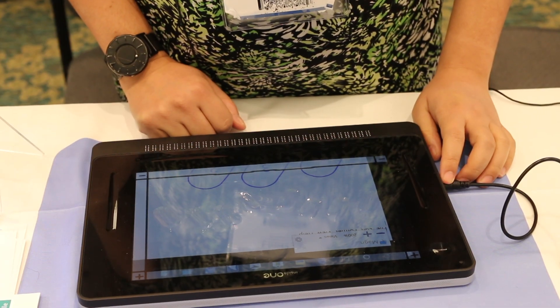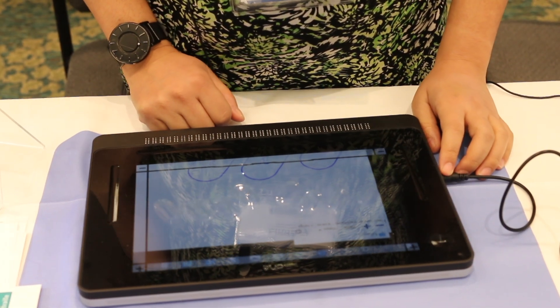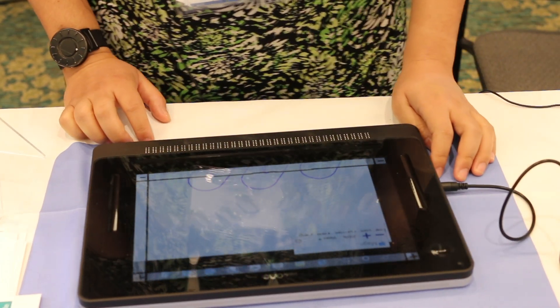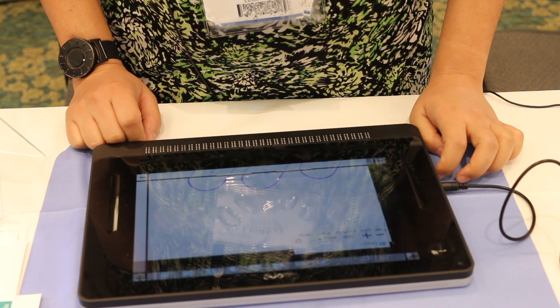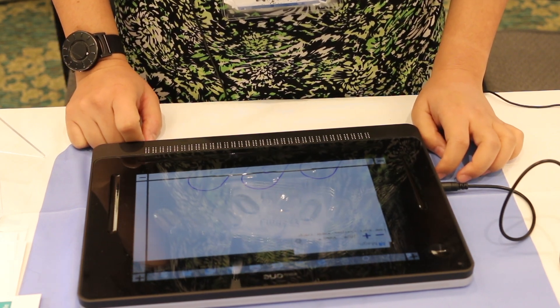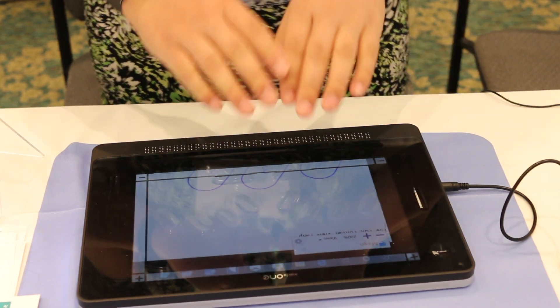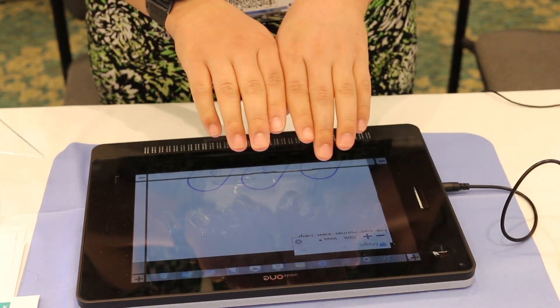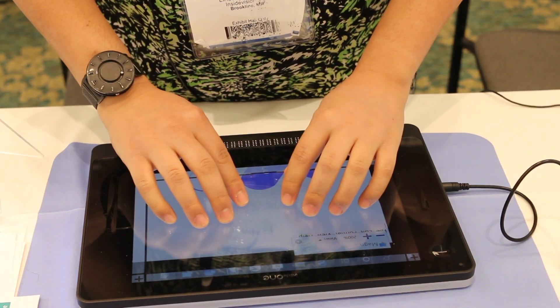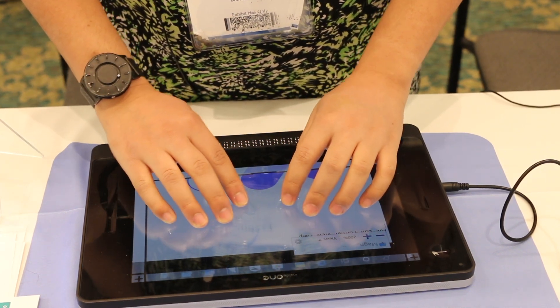The INSIDE ONE tablet comes with a refreshable braille display — 32 cells — which enables a blind person to read what they've typed. They can type using the on-screen keyboard, which is a braille keyboard embedded into the glass. It's engraved into the touch screen and it's a standard eight-dot braille keyboard.